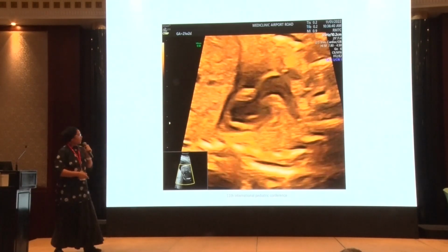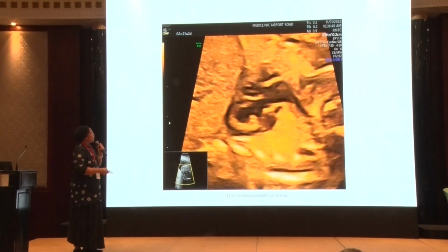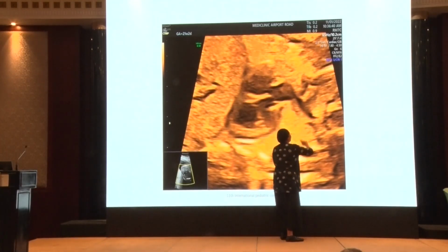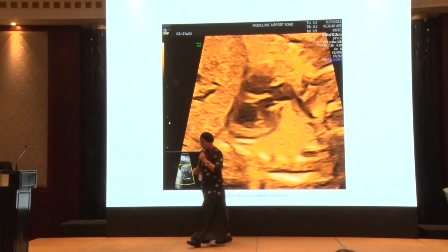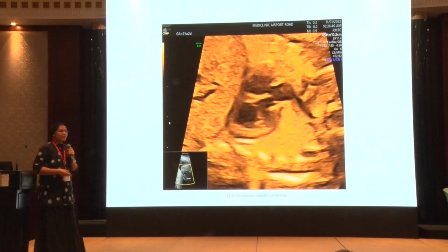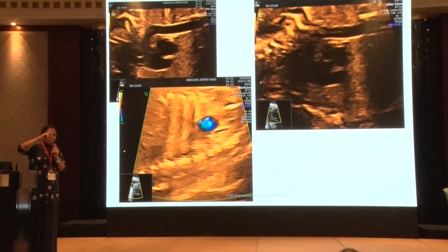Okay, it's not moving. Yeah, it's moving. You can see the branches here. Nice two here. So there is another trick to know the diagnosis, going further to the aortic arches. So when there is a single trunk, obviously there will be only one arch. There will not be two, an aortic arch and a ductal arch, isn't it? This is another clue.